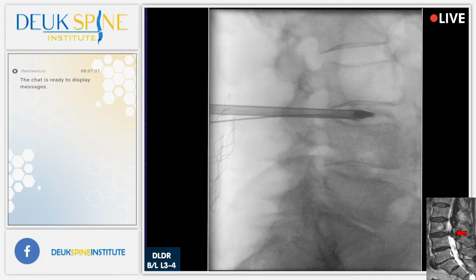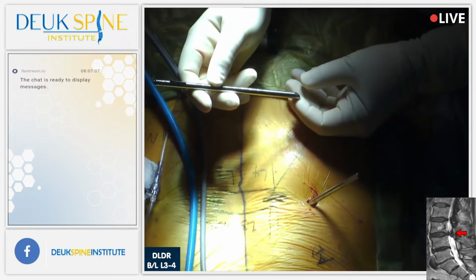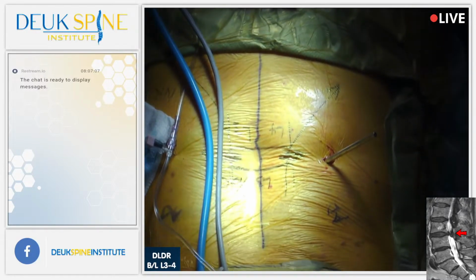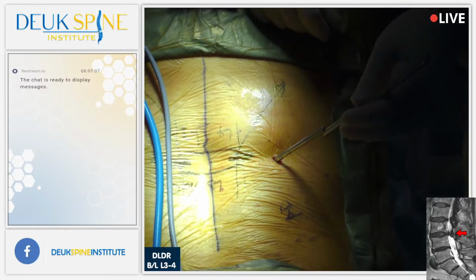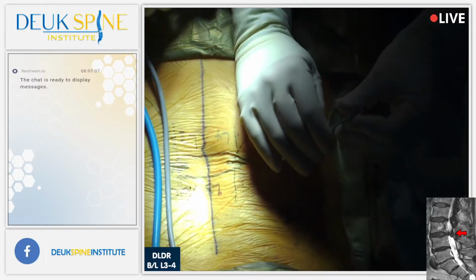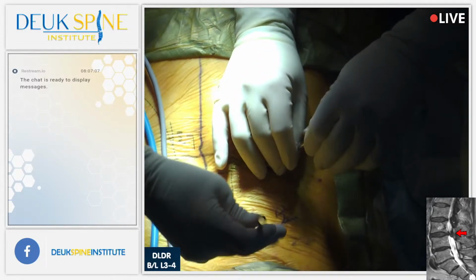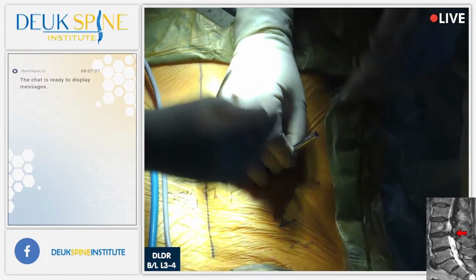The whole surgery is done through this beautiful little metal straw. This is endoscopic surgery, folks. This is the least invasive spine surgery in the world. There's virtually no bleeding. A few drops of blood. In spine surgery, we measure blood loss in milliliters, and a milliliter is 20 drops of blood.